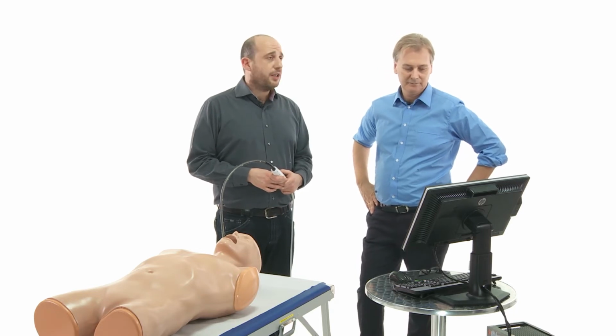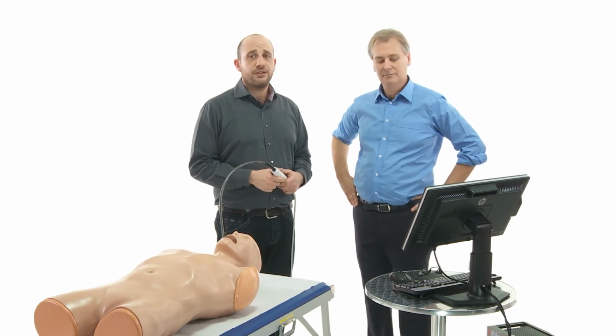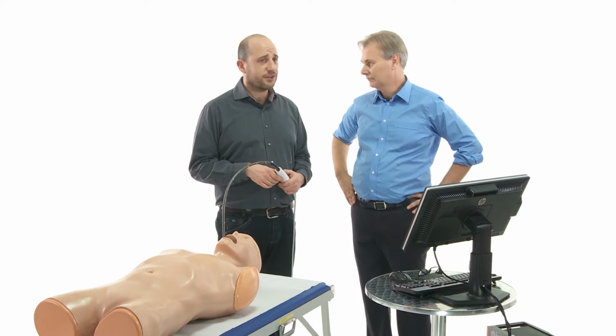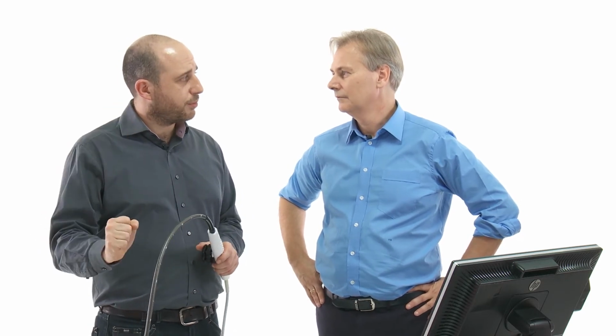We have 3 important movements to perform to get this image. The first of them, starting with the transgastric mid-papillary short axis view, we leave the anteflexion. It's very important to leave the anteflexion because you cannot make damages in the stomach. Then, very slowly, you put the probe inside till you feel a resistance.